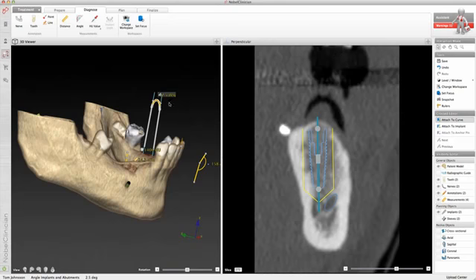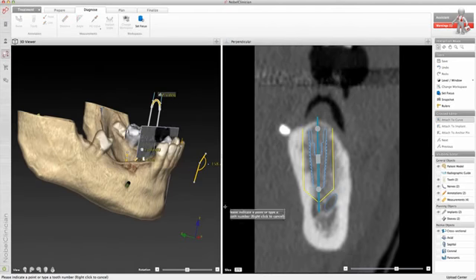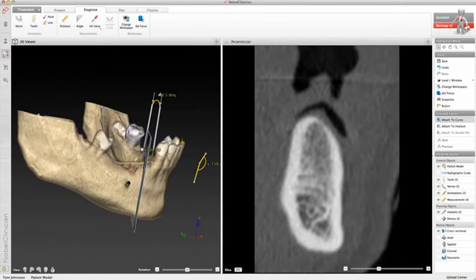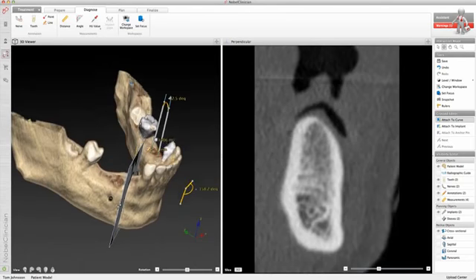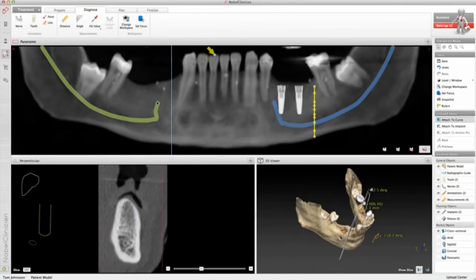The set focus icon allows you to set the position of the 2D reslice to a certain location on the 3D model. Press this icon and select a position on the 3D model. The cross-sectional reslice will automatically be located at this position. You can also use this action when in the panoramic workspace to indicate a position on the OPG or panoramic reslice. The cross-sectional reslice will jump automatically to this position.